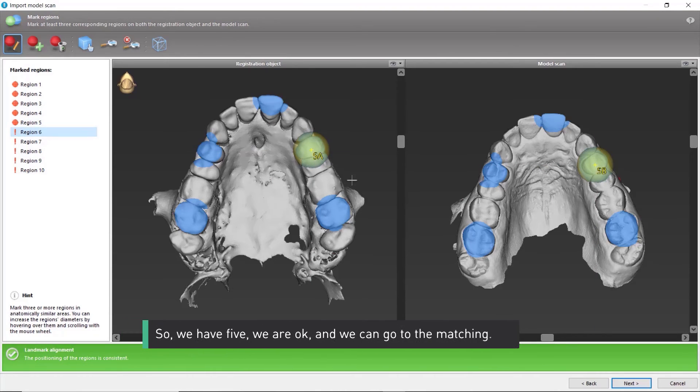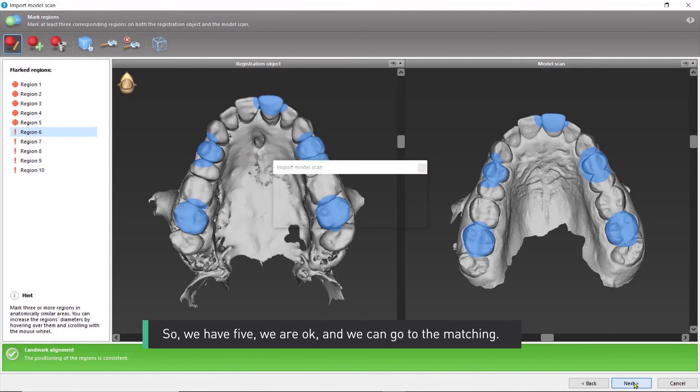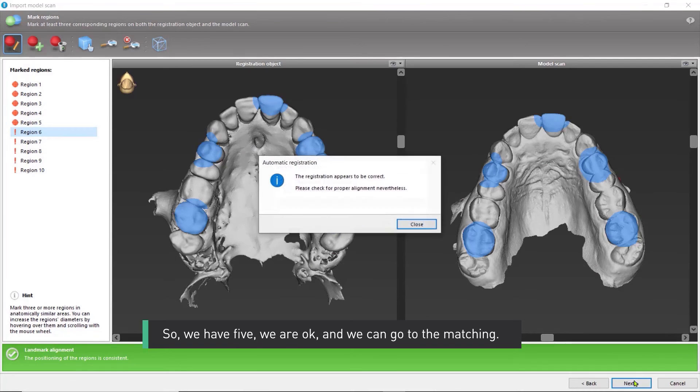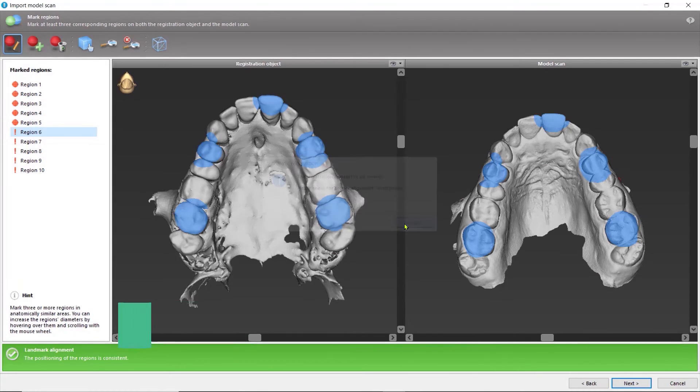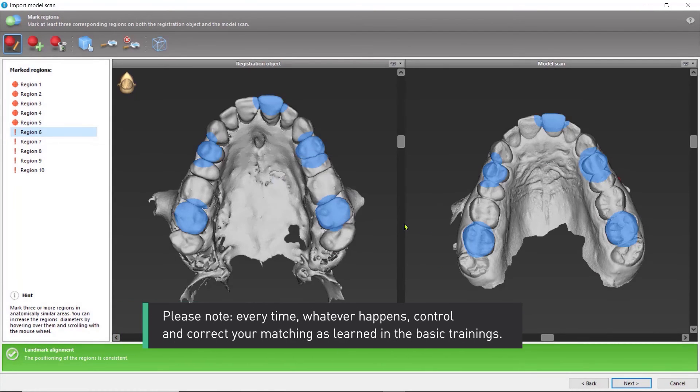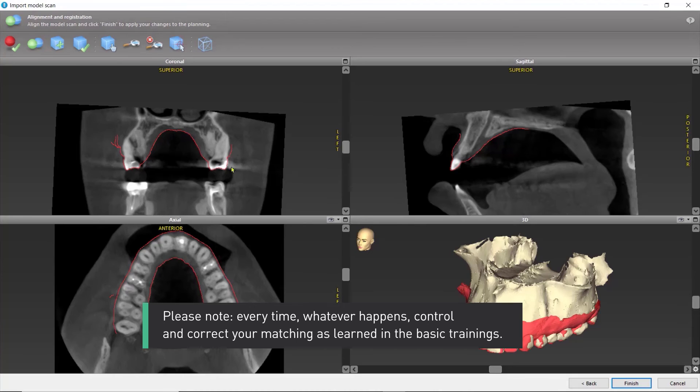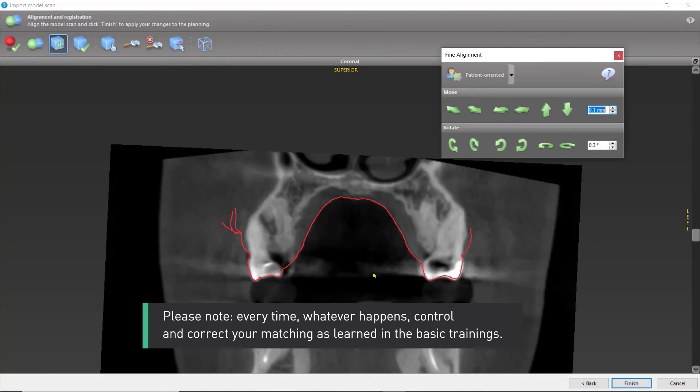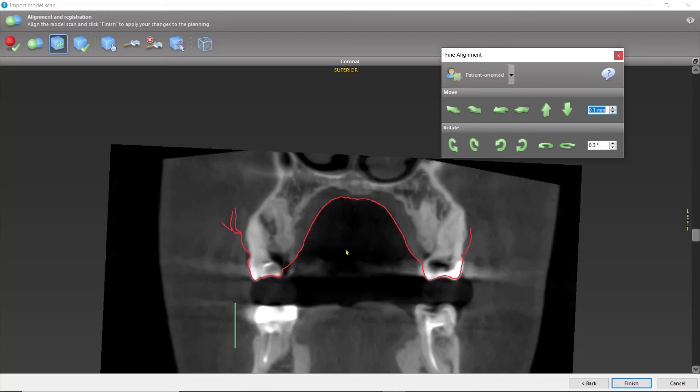So, we have five, we are okay, and we can go to the matching. Please note, every time, whatever happens, control and correct your matching as learned in the basic trainings.